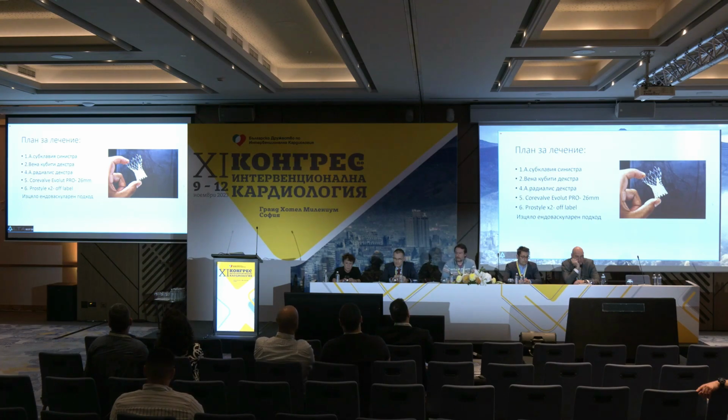The valve that they are going to use is the CoreValve Evolut Pro, 26 millimeters, ProStyle as a closure device, and it will be a totally endovascular management.